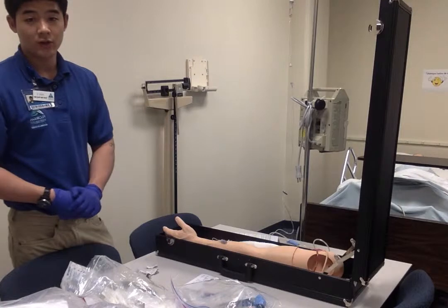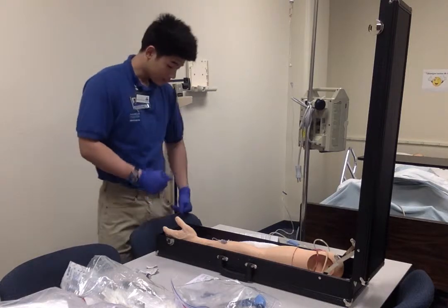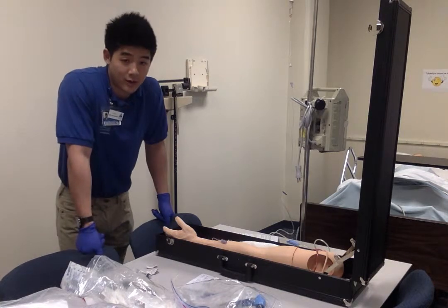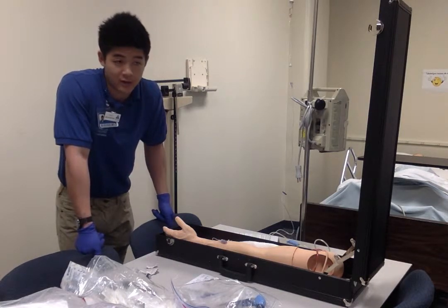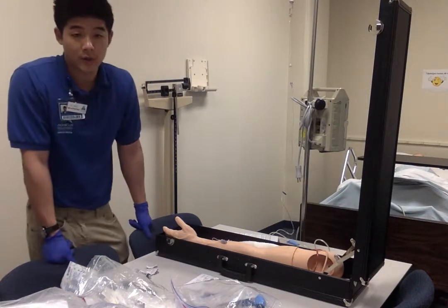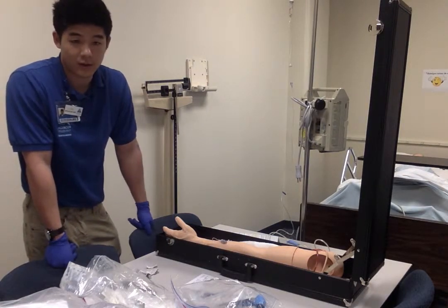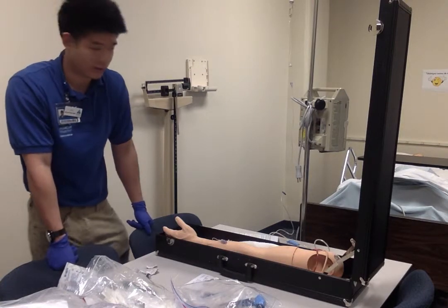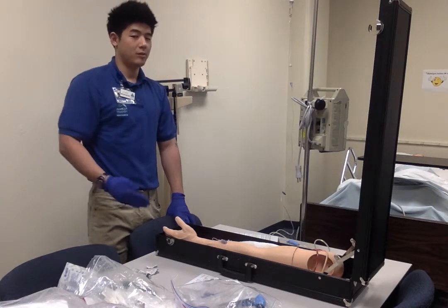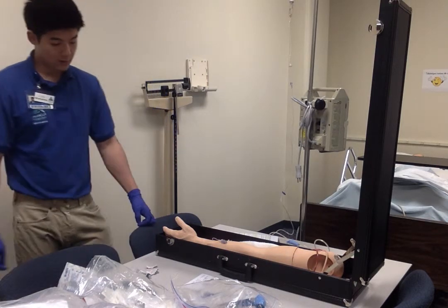After this, on doctor's orders, I'm supposed to give heparin, but for this purpose, we won't give heparin. Also, I'm going to document how the IV site was, if there are any abnormalities, such as phlebitis or infiltration. Based on my MAR, I'm going to write down my dosage, route, time, date, also the patient's initials and my initials. And the final thing is I have to do the intake and output for the patient and how the patient has handled it. And that'll be all.